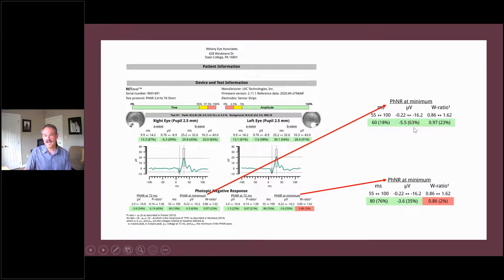And the amplitude in the right eye is 63%, not bad. The amplitude in the left eye is 35%, not nearly as good.